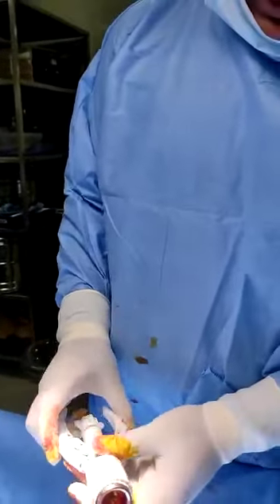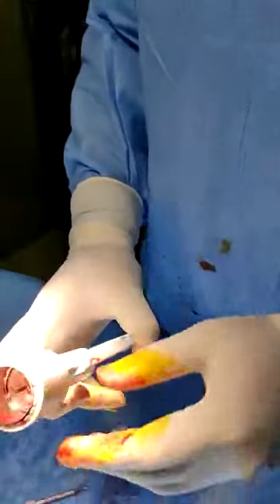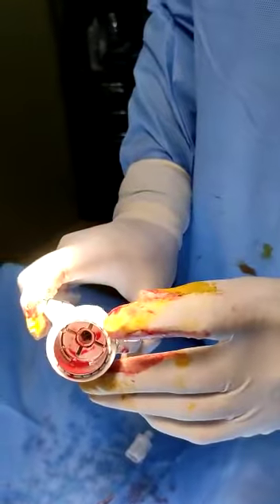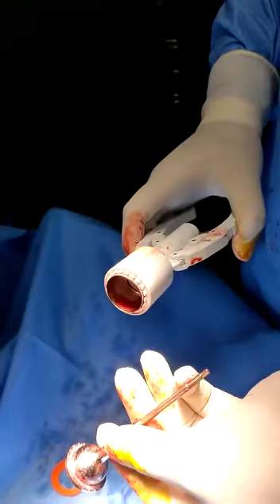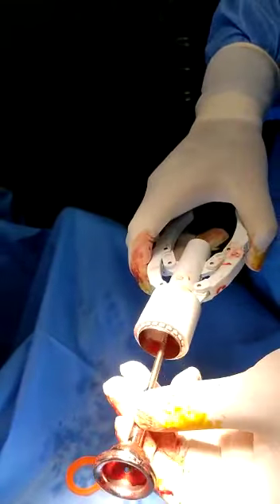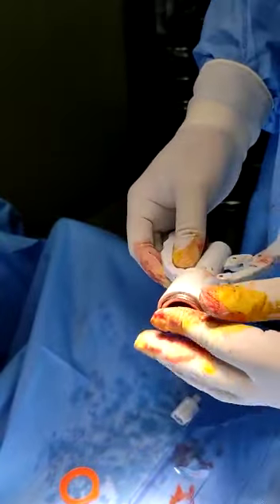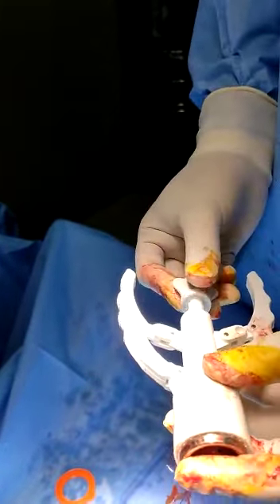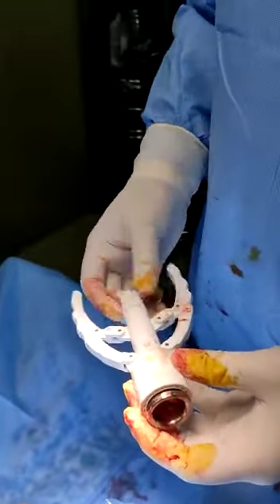The staplers are here — this is now empty. You can see this ring; the staples are here. The staples come and hit this one, and there is a silicone ring. Everything is released once you fire. Once you fire, you have to just pull it out, and along with this, the skin ring comes out.